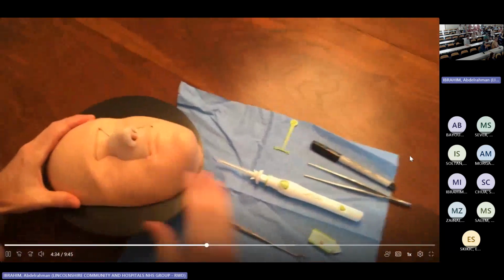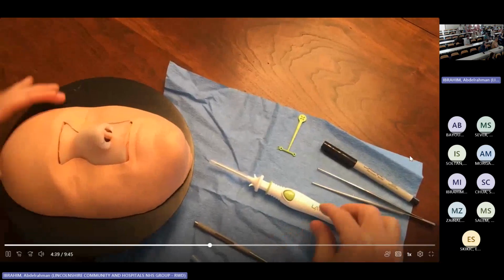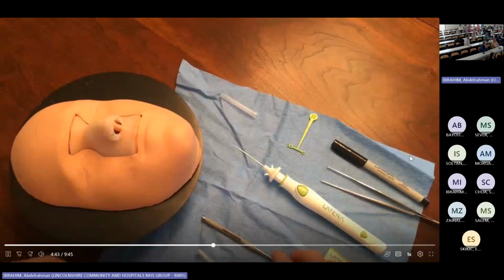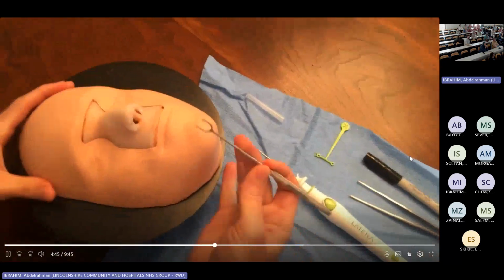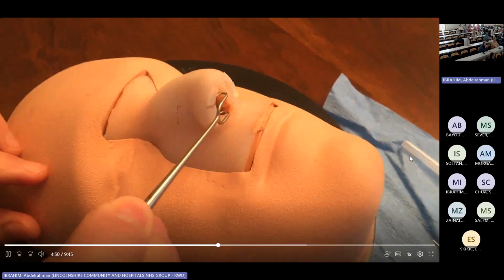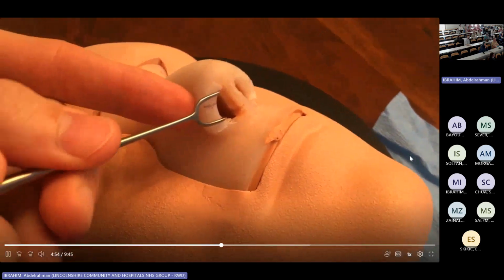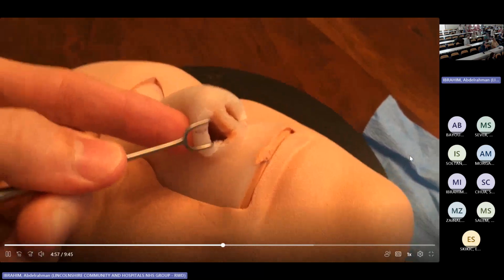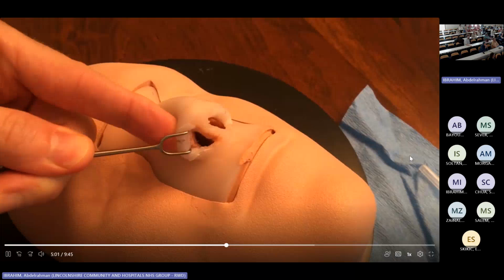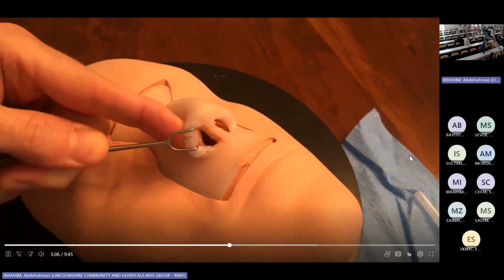So I have my markings. I have my delivery device. I'm ready. At this point, I will uncap the safety cap on my delivery device. I will pick up my double prong skin hook. I will span my mark with the double prong skin hook. I will position my hands down low and put pressure against the back of the ala to get a firm grip on the double prong skin hook and evert the ala.